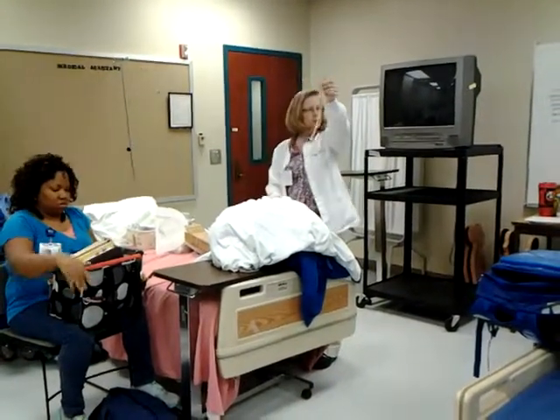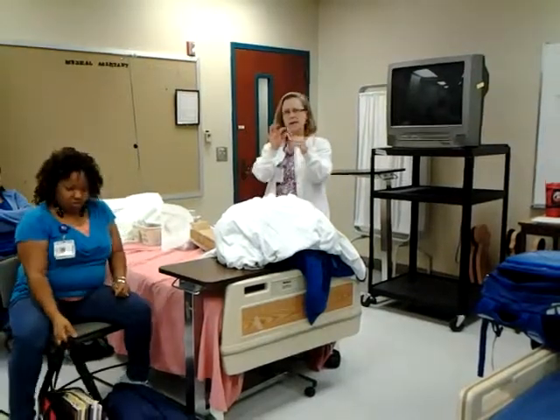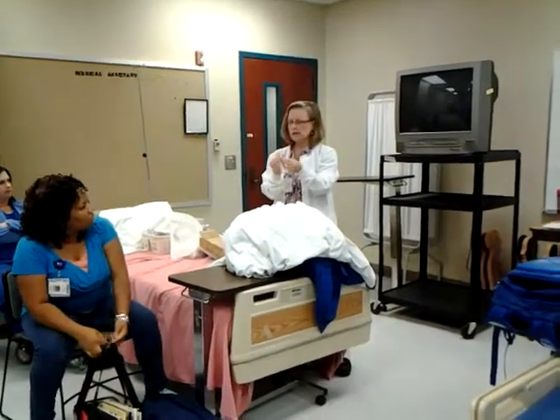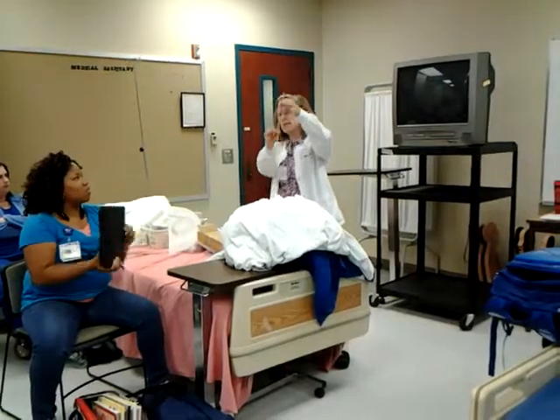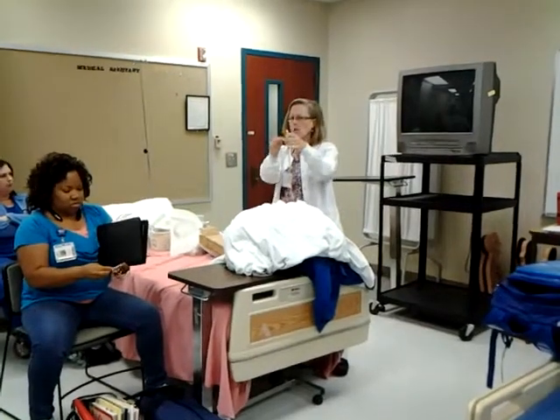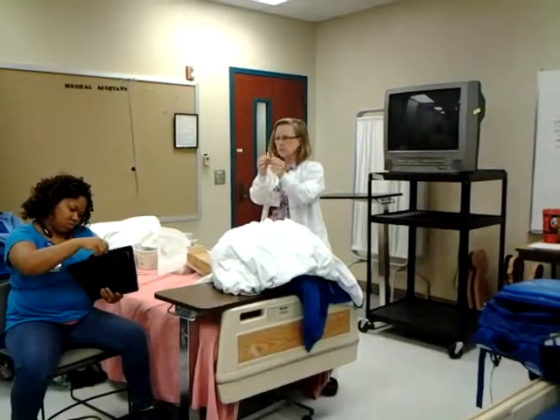This is a typical catheter you'll see in your kit — this one is a 16 French. A pediatric one might be an 8 French, just to give you a sense of sizes. This is a 16, and it looks like one lumen, but within this casing there are actually two lumens — two tubes that go all the way to the end. One of them hooks up to the drainage bag to collect the urine.